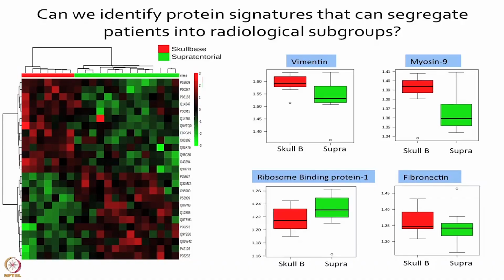So, once we do the screening, as you can understand, in the protein arrays we are taking one chip and one patient serum sample. So, we are generating data which is all distinct. One could reanalyze the data in different manners, based on the WHO grading scheme or based on the radiological classification.